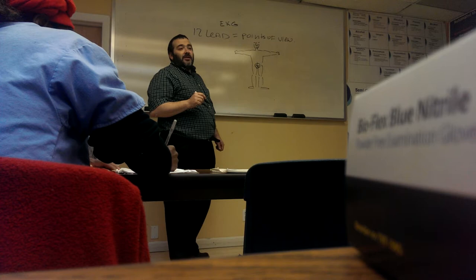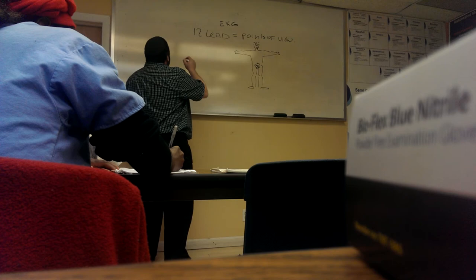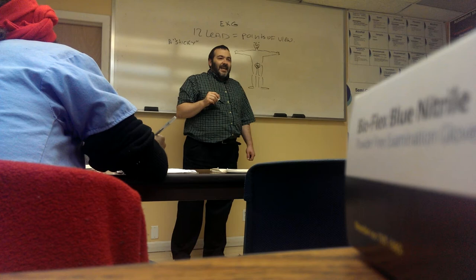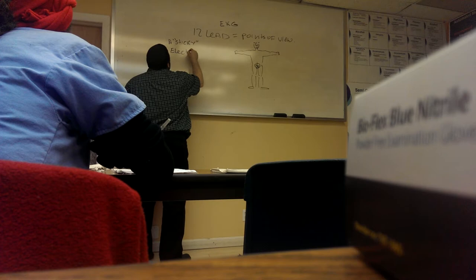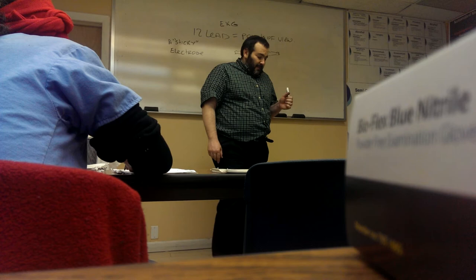Alright, so where do we place our stickies? Now, sticky is a rather technical term. I must explain myself. A sticky. Everybody knows what I'm talking about? Does anybody know a true technical term for the word sticky? Come on, guys. Oh, wait. Hold on. I'll leave you suffering. It's called an electrode. Who likes the word electrode? Doctors. Who doesn't like the word electrode? Patients.